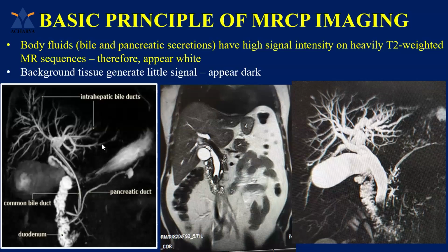What is T2? What is T1? T1 is short TE and short TR. T2 is long TR and long TE. But the image contrast based on TE is T2 weighted, while that based on TR is T1 weighted.